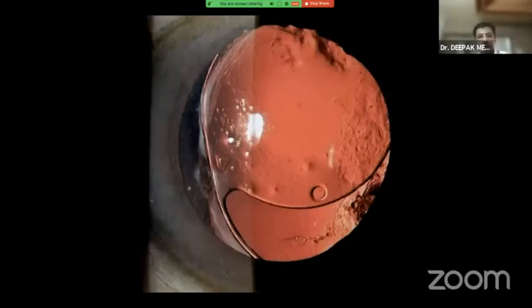But there are certain issues with bigger Rexis. Now, this is an eye with a PMMA lens and a very large Rexis, or maybe some other form. We are not able to see the Rexis size. So what are the consequences of this is, after 2-3 years, the bag starts to contract, we have fibrosis, and you can see there is a slight decentration of the lens. What it eventually leads to is refractive instability.